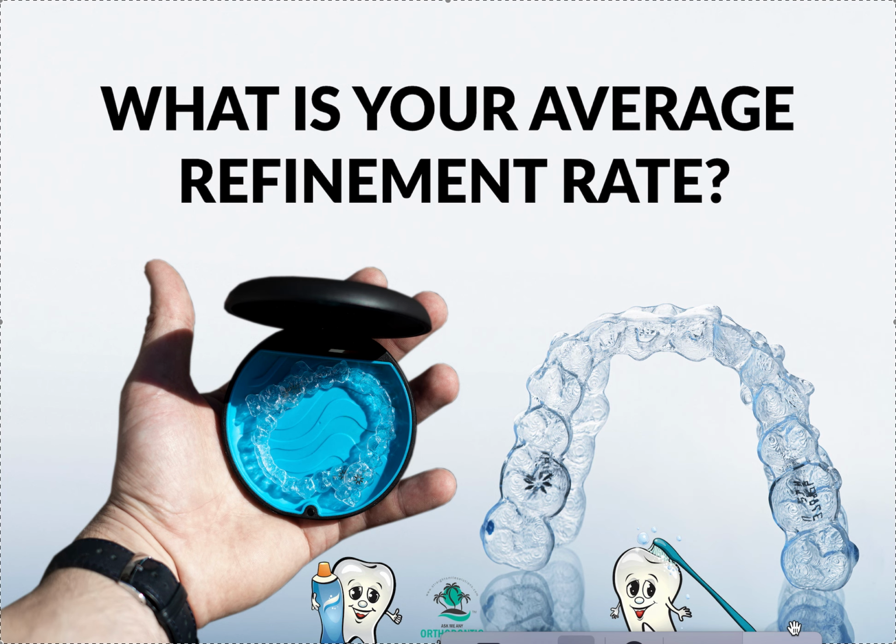And none of us are perfect, right? But just like you can use indirect bonding to have a computer digitally place your brackets to decrease the likelihood of needing bracket repositions, you want to get it right the first time and just sail through, right? You can do the same thing with aligners. First of all, you can have an orthodontist double check your Clincheck to make sure it's a decent Clincheck. Remember, you never do what the technicians say. The technicians are not orthodontists, and if they say they are, they're lying. They may have one on staff that's trained in another country, trust me.